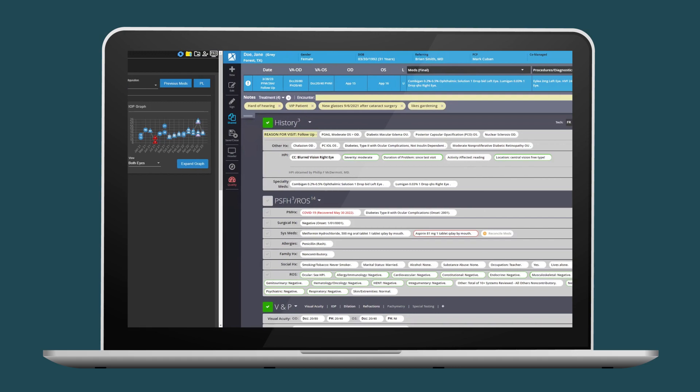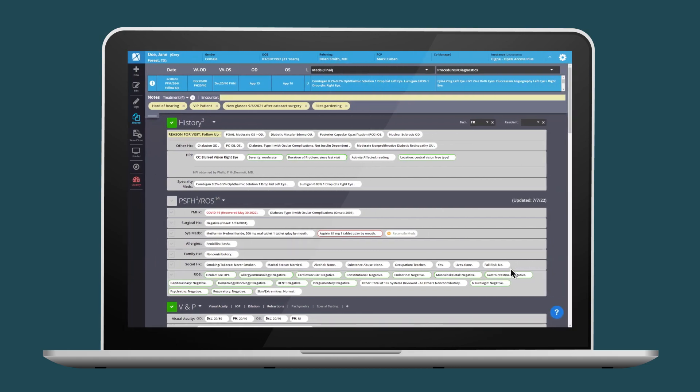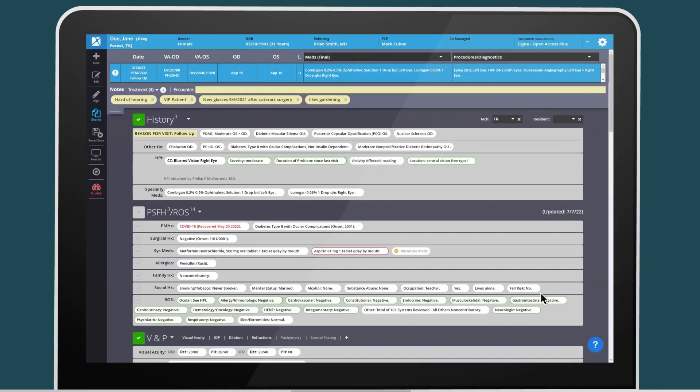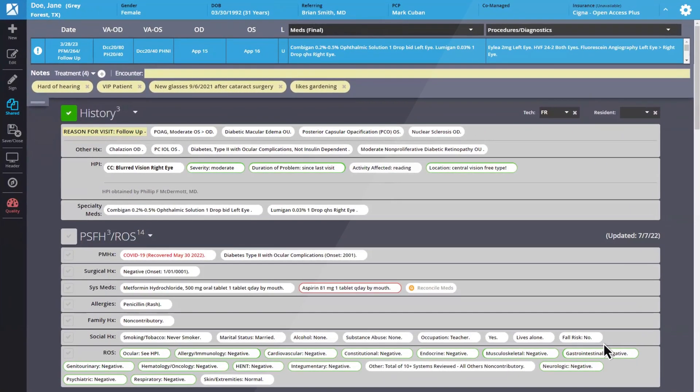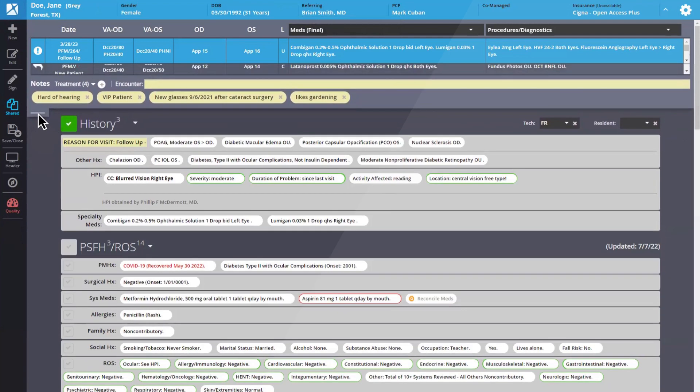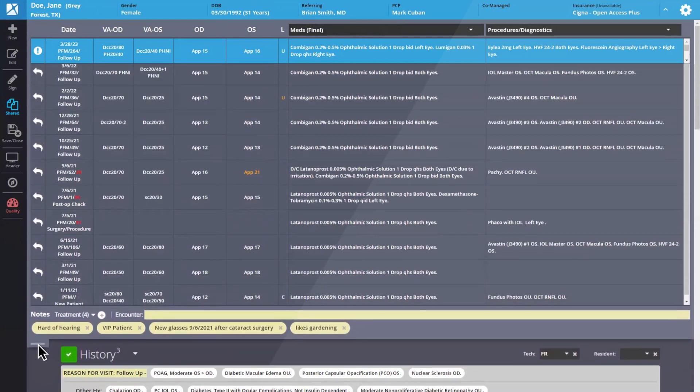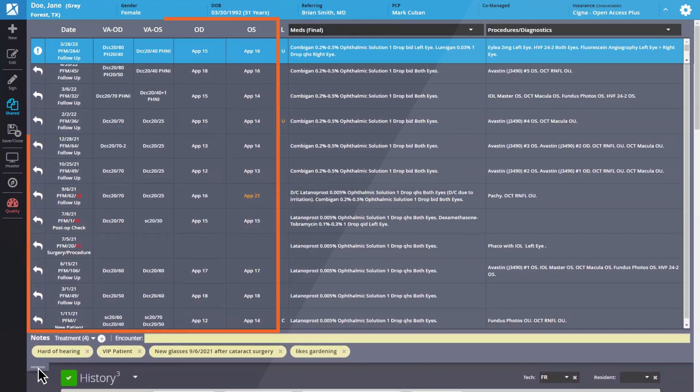From one screen, providers can view a snapshot of historical data, patient risk factors, most recent diagnostic testing dates, and targeted treatment plans.